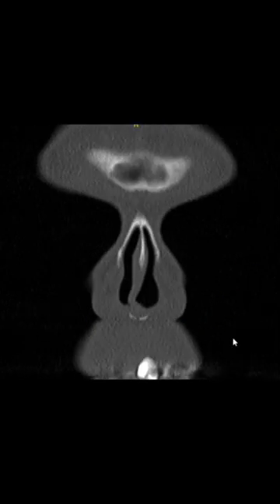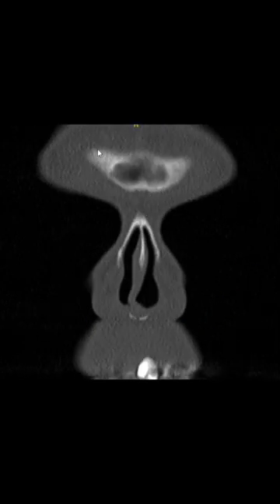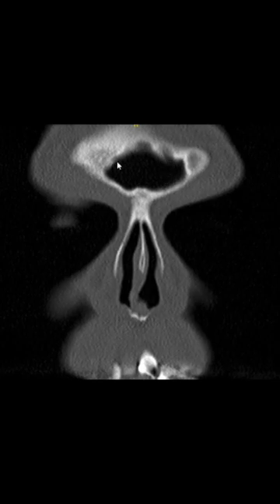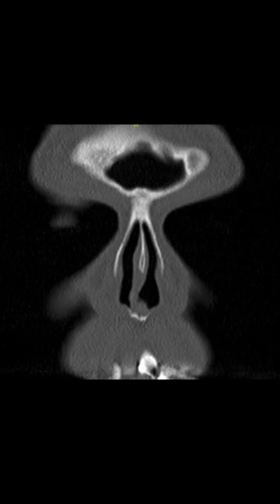As we go posteriorly, the first bony landmark on the forehead that we see is the frontal sinus and its anterior wall. This is the nasal spine. This is the cartilaginous part of the nasal septum. As we go further in, we can see a large aerated frontal sinus.